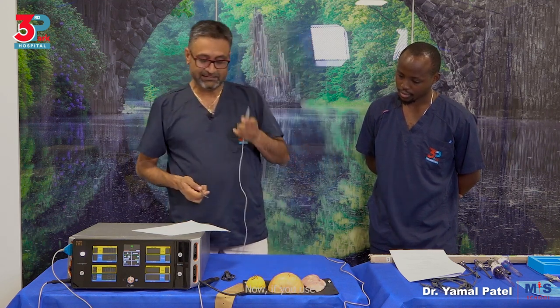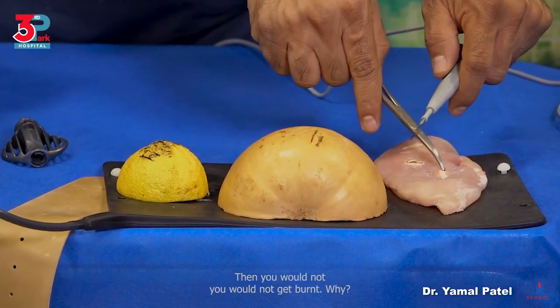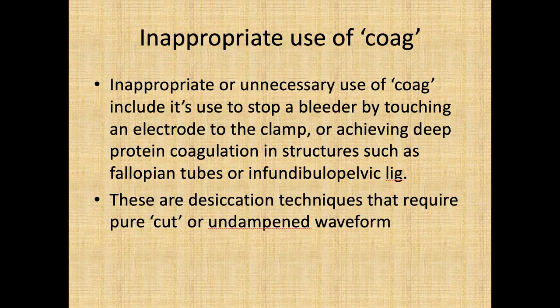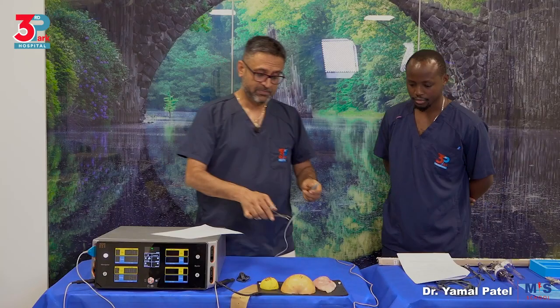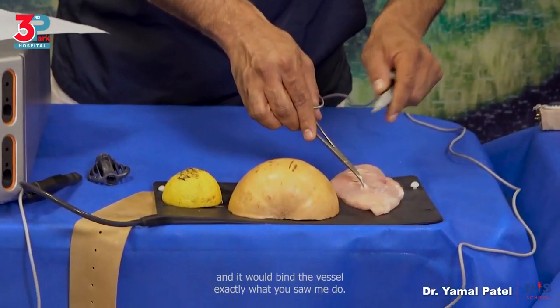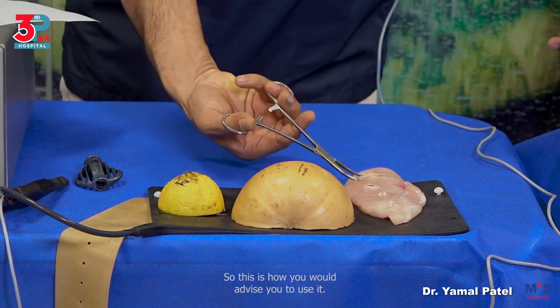Now, if you use the yellow in that scenario, like this, you hold it and you use the yellow, then you would not get burnt. Why? Because it's a low voltage current and you're supposed to use the low voltage current to buzz that vessel. So it's very important that you understand, when you have held a vessel and you have been told to burn it, you would use the yellow and it will burn the vessel. Exactly what you saw me do. Hold it, activate it, and it burns. So this is how we would advise you to use it.